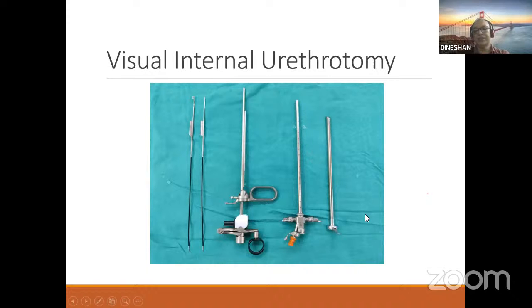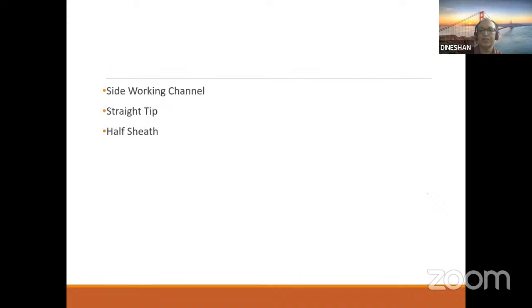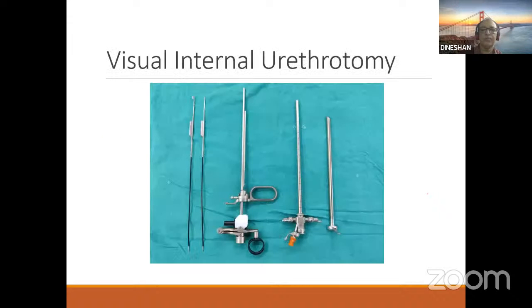The advantage of the half sheath is that once you cut the stricture and take the whole scope out, sometimes your catheter may not go inside because the urethra, the stricture, will collapse, and it will not allow the catheter to go in. So once you assemble this with the half sheath, and you complete the incision, you can take out the assembly with the working element and retain this half sheath there.